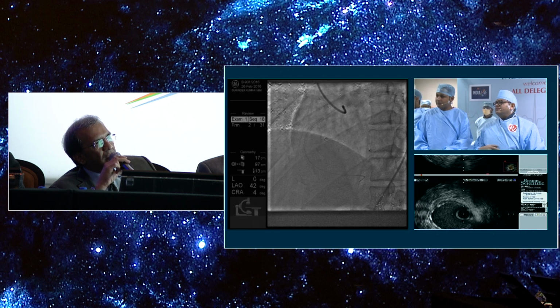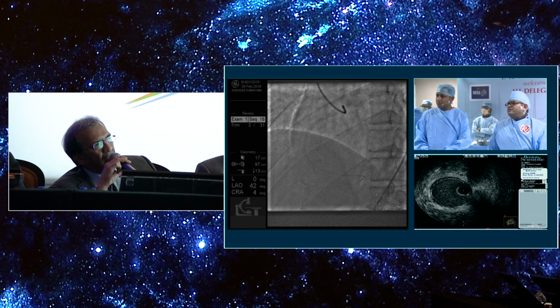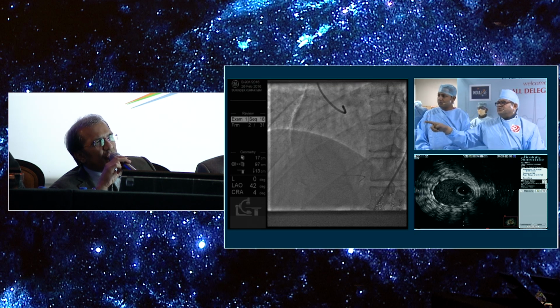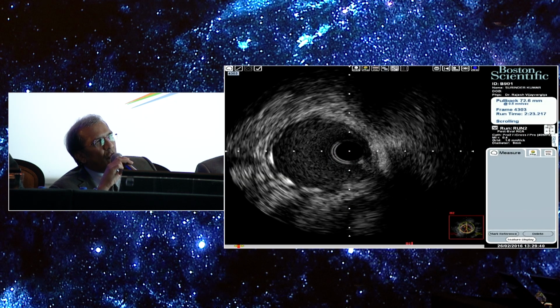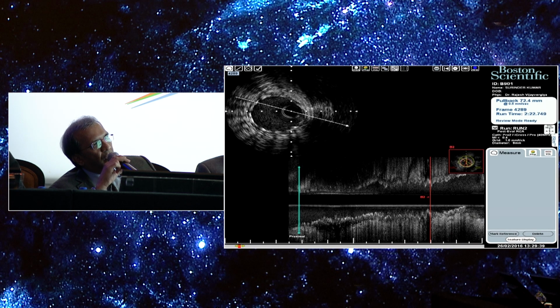That looks like the distal end. Here we are at the proximal end of the stent. No, is it proximal? Can you have the longitudinal view, and then you can see. This is the proximal end. Can you have the longitudinal view down? Okay, now go ahead. Now go proximally. Yeah, here this is the end. Yeah, so come to this end. Go proximal. Yeah. Go into the stent.